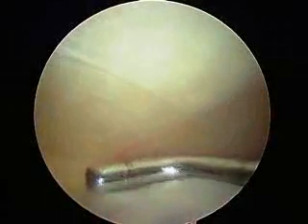Now we're going to go in the medial gutter. There's no loose bodies in there. This is on the inner side of your knee. That looks pretty normal. Okay. Now we're going to go over the top, straighten the leg out. I'm going to show you the patella, and I think this may be causing some of the problem.